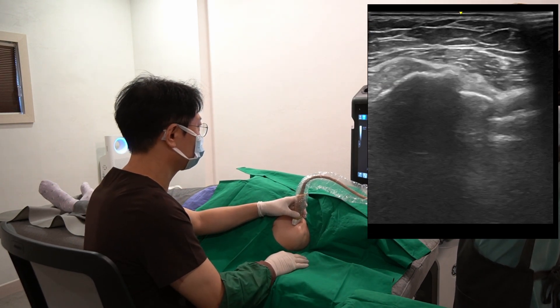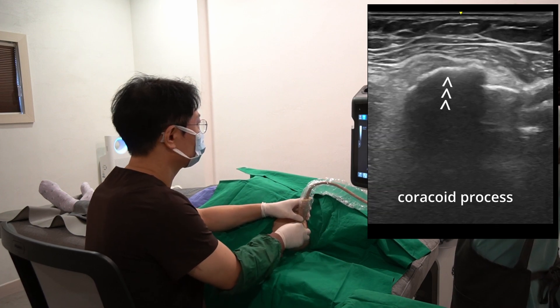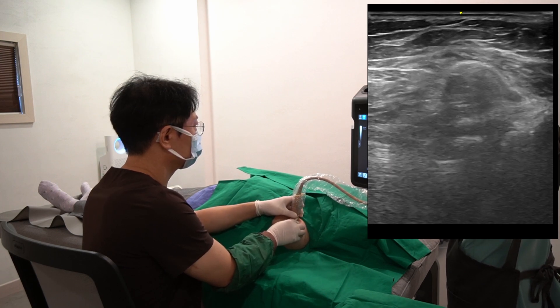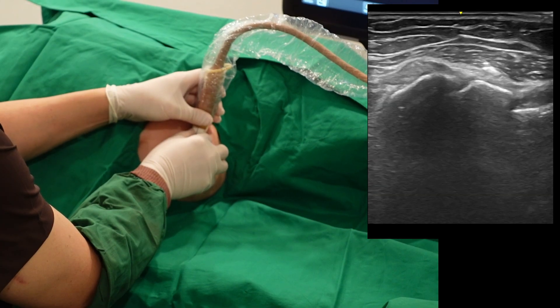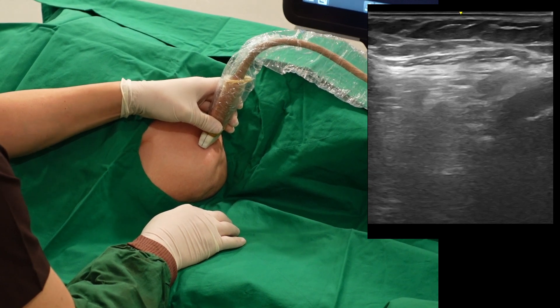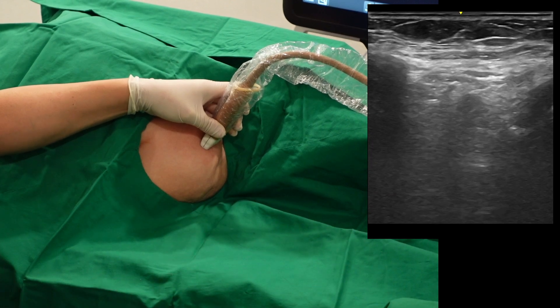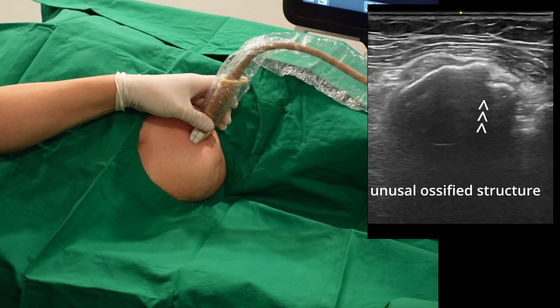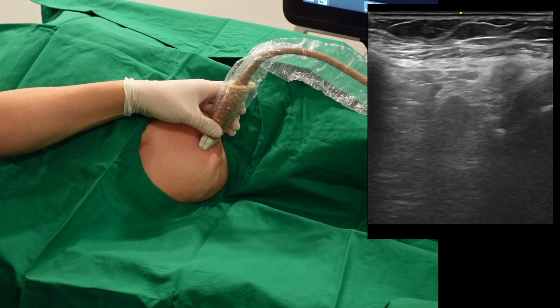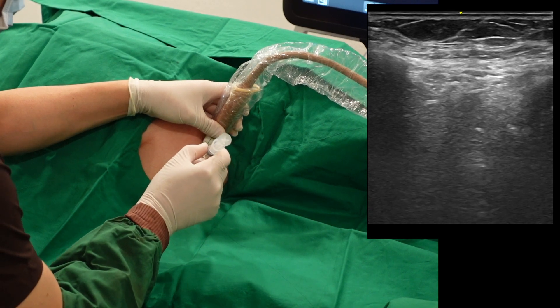Let me scan it first. I am watching the transverse scan at the upper border of the coracoid process. I found a round cortical echo of the coracoid process on the left-hand side, deep to the deltoid muscle. I found an unusual echogenic structure similar to the coracoid process, but it is in the deep superior aspect of the coracoid process — it is an ossified structure in the coracohumeral ligament, separated from the rotator cuff or humerus head. My first needle target will be positioned above the coracohumeral ligament, at the 12 o'clock position of the scapular glenoid.